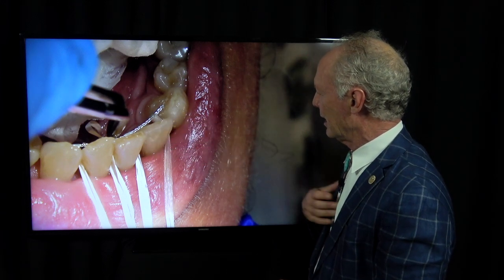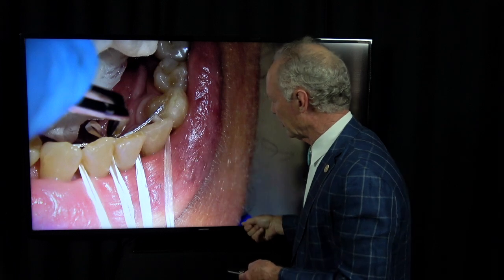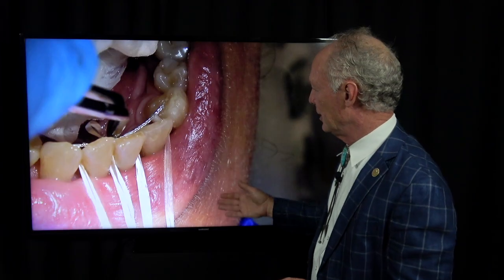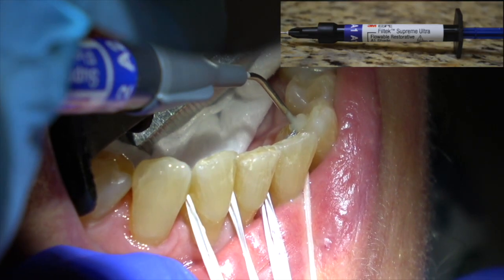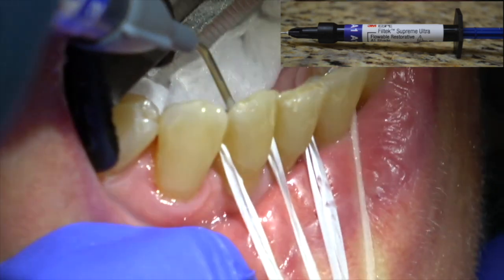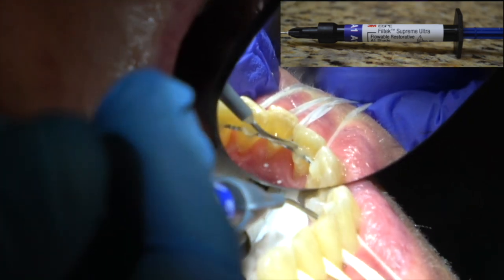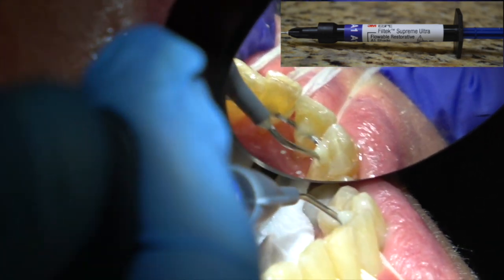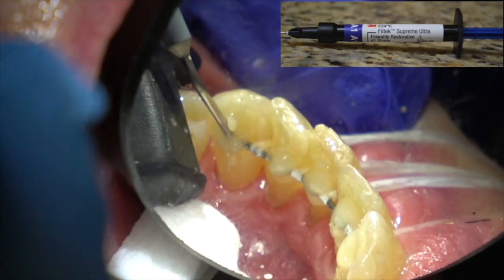I elected not to put any filled resin or flowable composite on the teeth before pulling them tight — there's just too much going on. You're trying to keep saliva off of it because if saliva gets on it, it's going to contaminate the bond. So it was enough just to put the primer adhesive and get the wire in place pulling the floss tight. We just pulled this tight on the teeth and now I'm going to squirt the flowable composite on the teeth. Just put some on there to stabilize it.